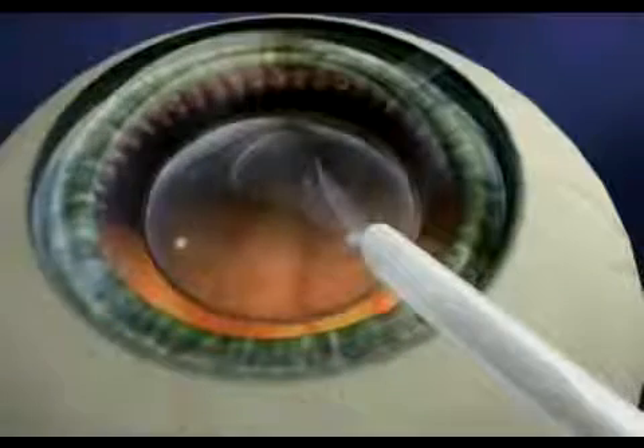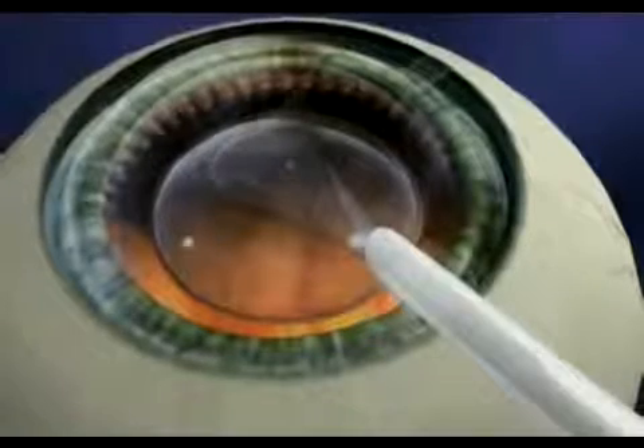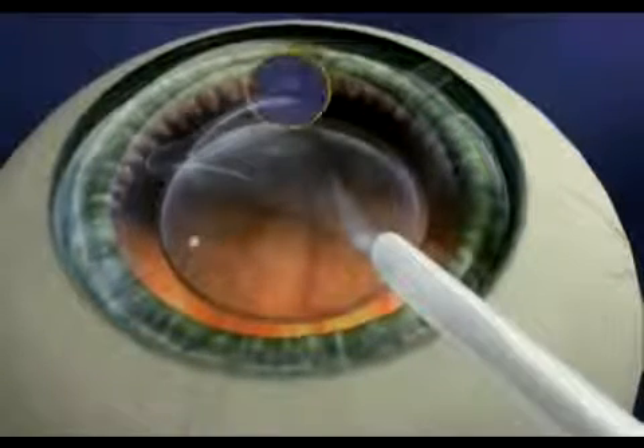Once you're comfortable, your surgeon will begin the procedure. As the lens is injected, it will gently unfold in your eye. Special marks on the lens ensure proper positioning.